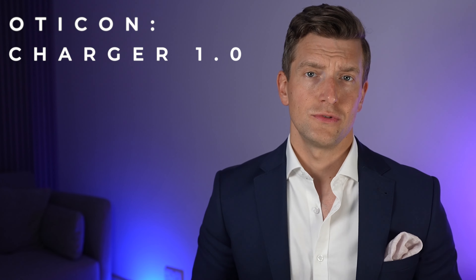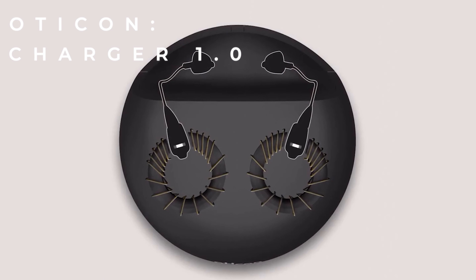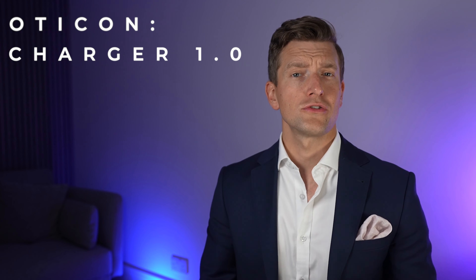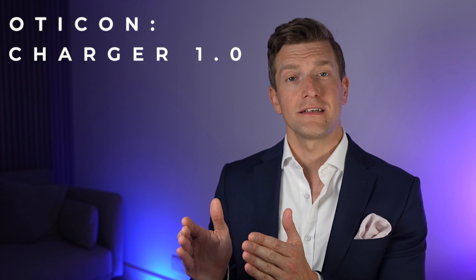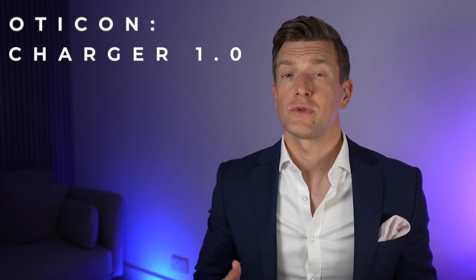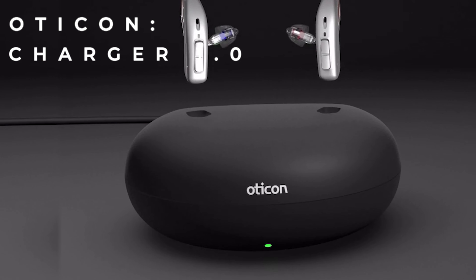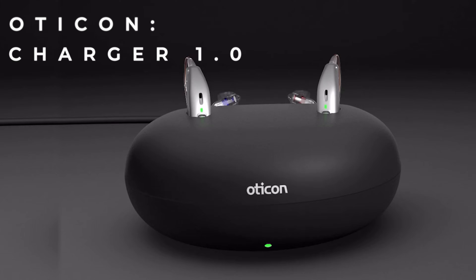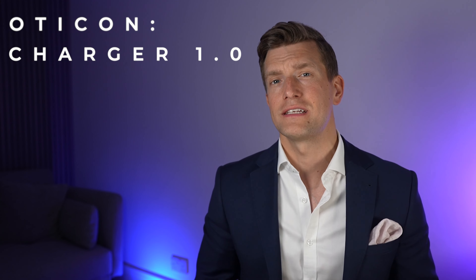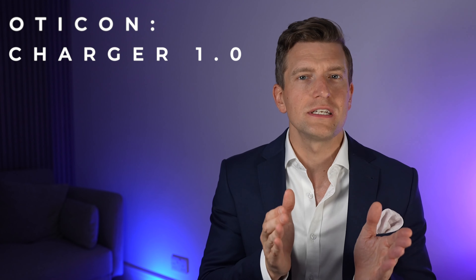It is simple in design and intuitive to use. To charge the hearing aid, it uses inductive charging rather than conductive charging, which means there are no physical contacts built onto the hearing aids. This is advantageous for two reasons: firstly, it makes the hearing aids more durable, as there are fewer routes of entry for moisture; and secondly, as there are no physical contacts, they can't wear out over time, so the hearing aids should be just as effective at charging on day one as after a few years. You can simply drop the hearing aids into the charger and they slot into place with a magnetic pull, rather than having to physically lock them in place, which can be difficult for those with dexterity issues.